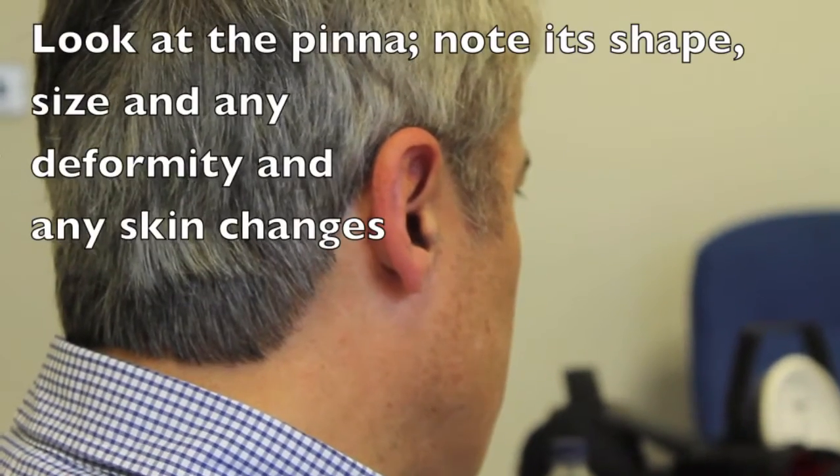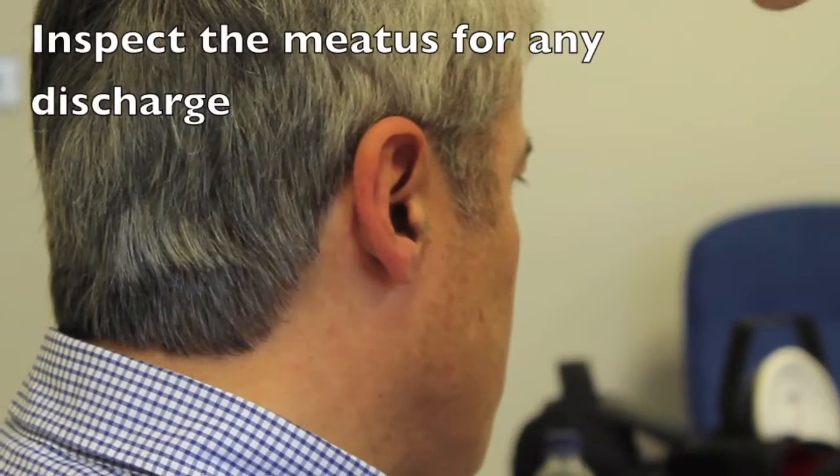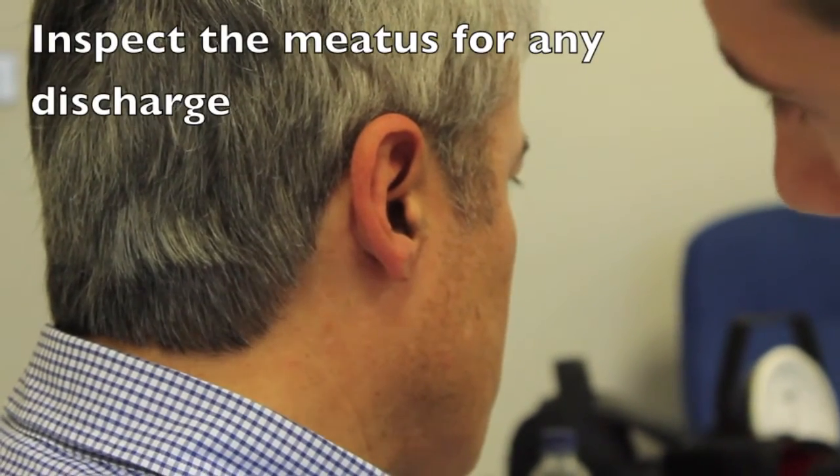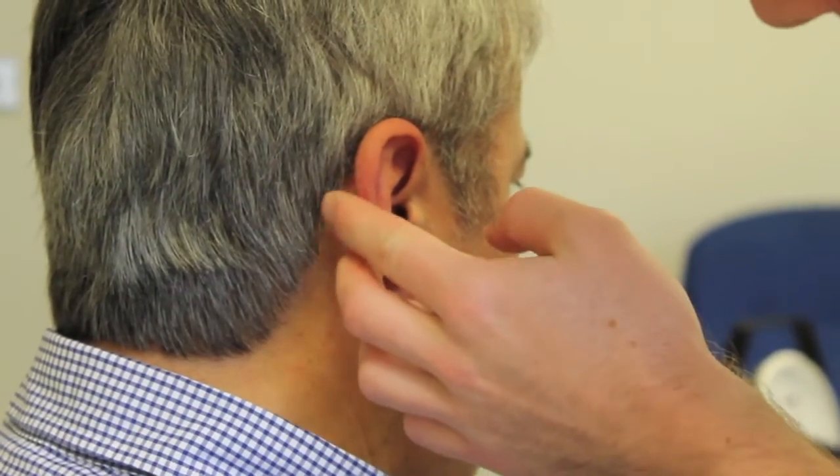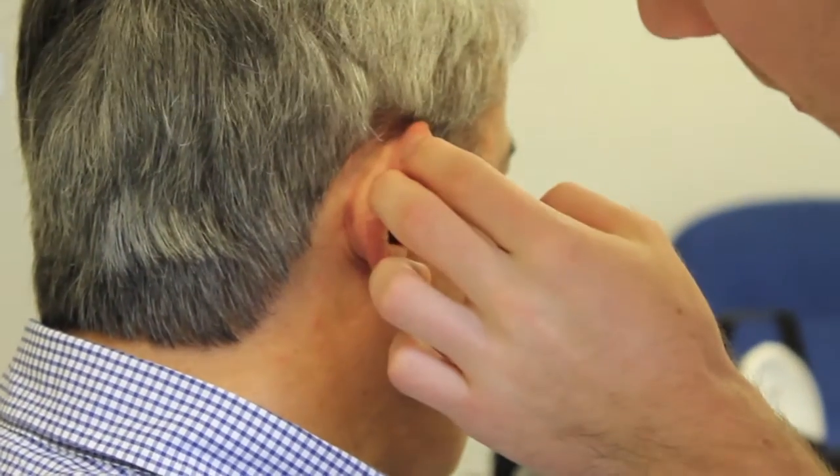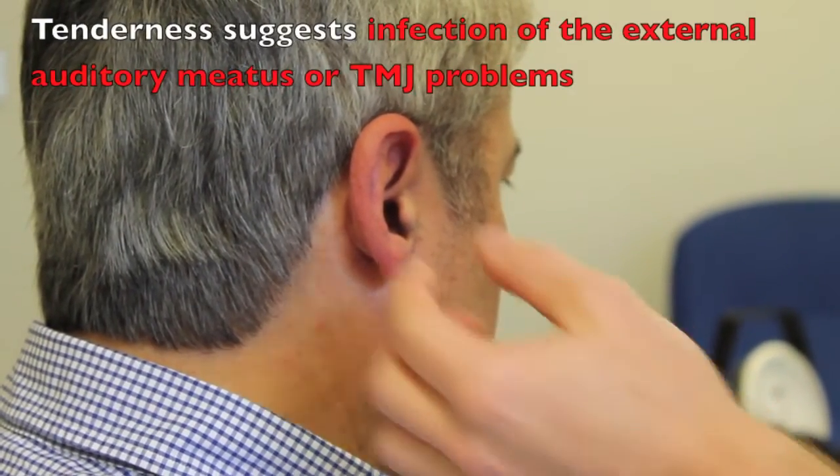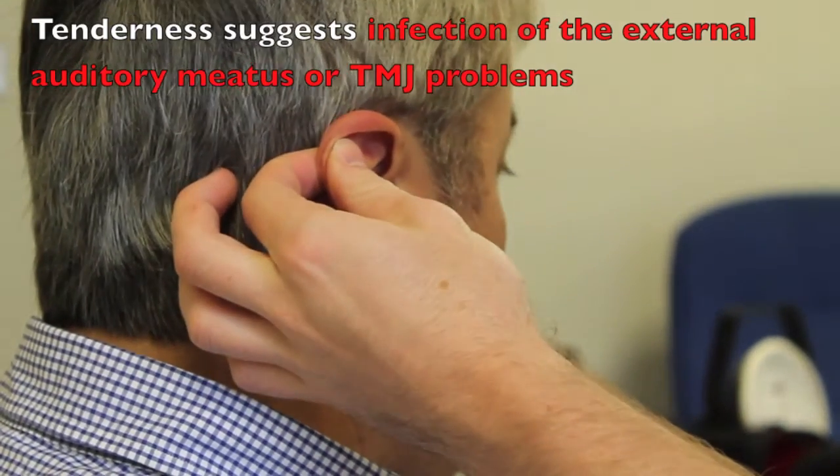Fine. I'm now just going to have a look on the outside of your ear. Is that okay? Fine. I'm now going to pull back on your ear. Let me know if you feel any pain. No.